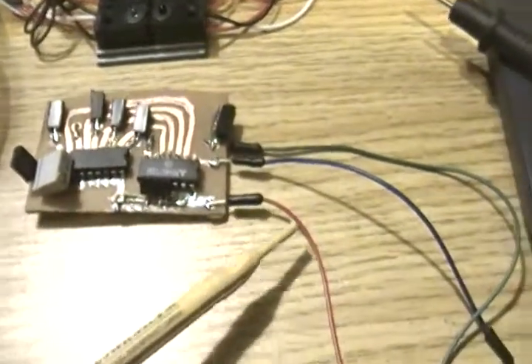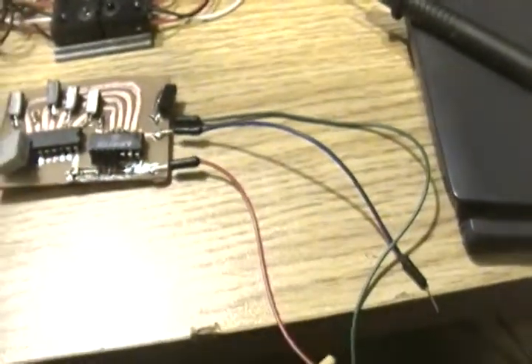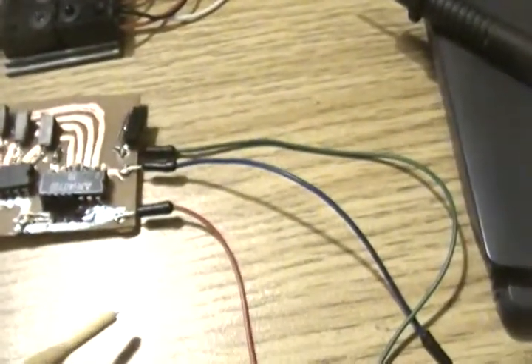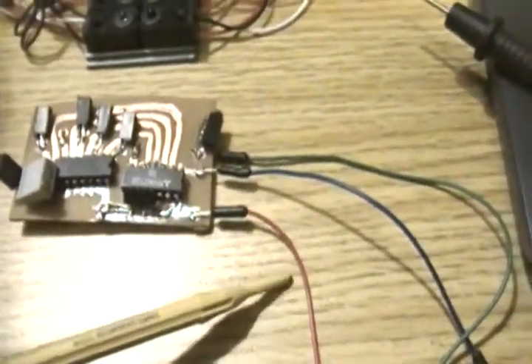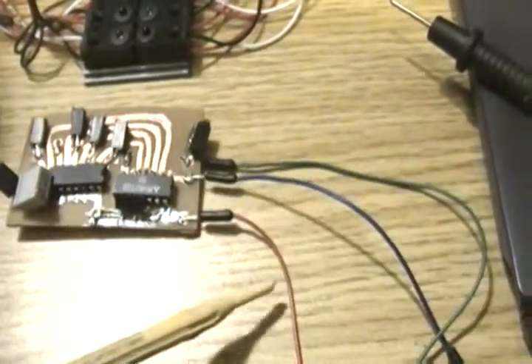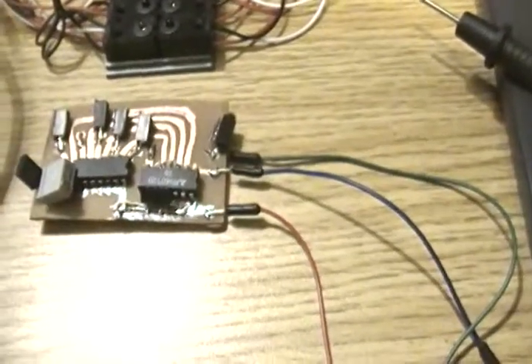Then you plug this into the 5 volts of the Arduino, you plug this green wire here into the ground of the Arduino, and you plug the blue wire into the interrupt pin of the Arduino. There you go, 3 wires out, red, blue, and green: 5 volts in, data to the interrupt, and the ground.